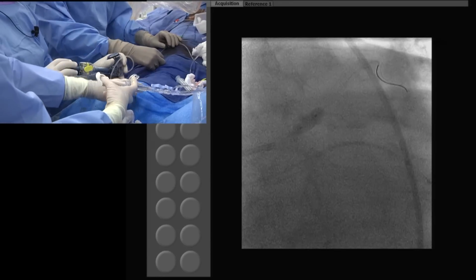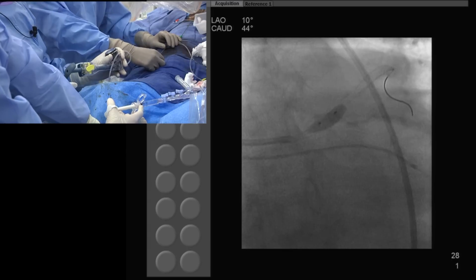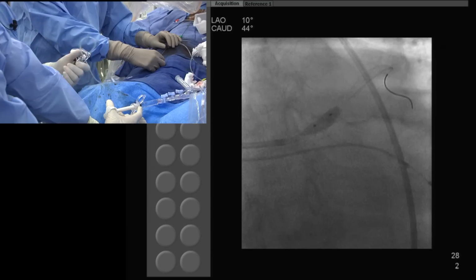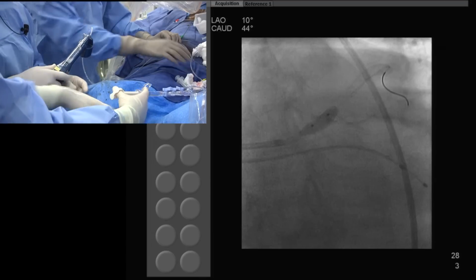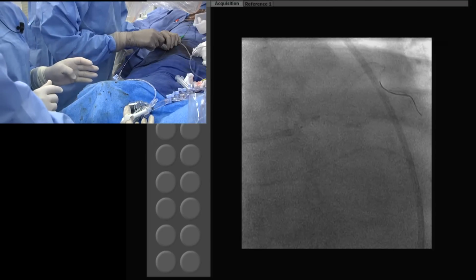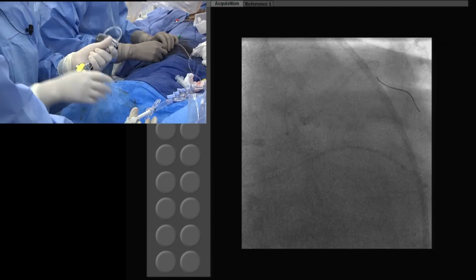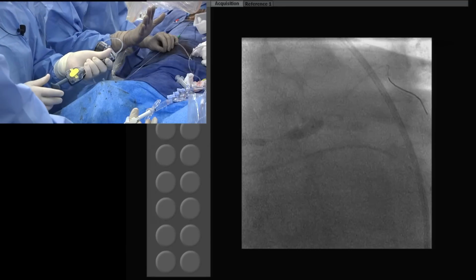Aneurysm, yes, good. You want to go higher? No, down. Distally. No, not with this balloon. Down. I'm not a believer of massage. Okay, now here, ostium. So we know we are nicely there. Okay, go up here. Now I was supposed to get the stent, boost enough. Yeah, good. Down.